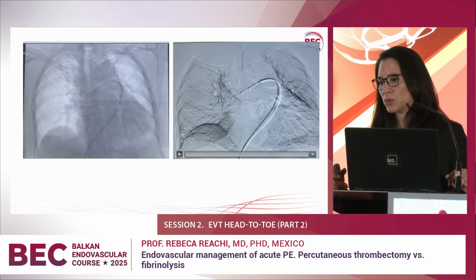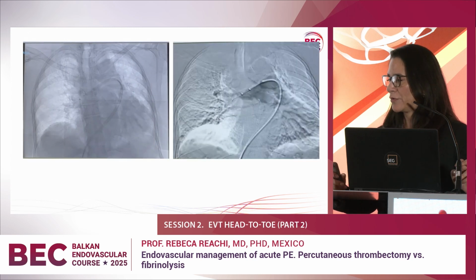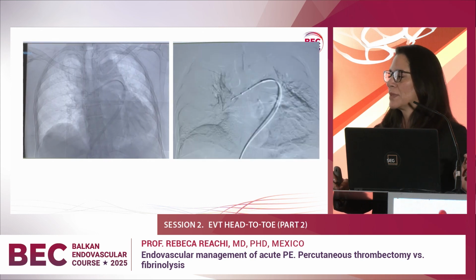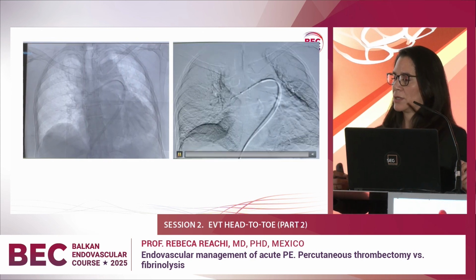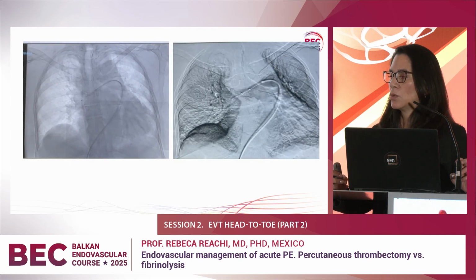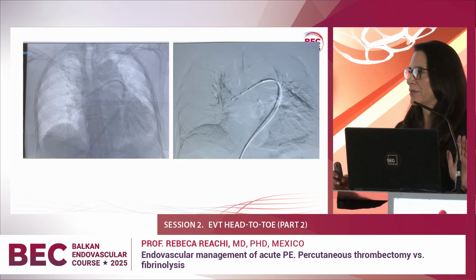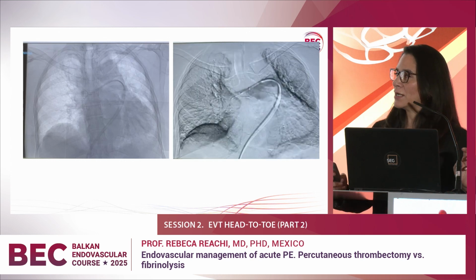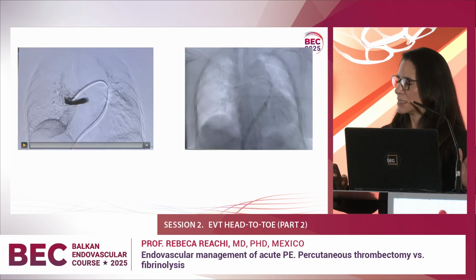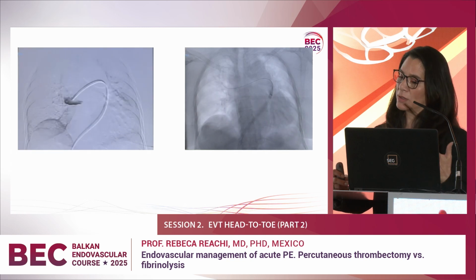So we try to do it easy. We only perform all the treatments with an anesthesiologist for everything we needed. And in this time, we were managing a lot of pressure inside the pulmonary arteries. We have a lot of issues with the heart, with the rhythm of the heart, with the pressure of the patient. So we try to do it the best we can, and we have a lot of time inside the room. So we didn't have the result that we were expecting.